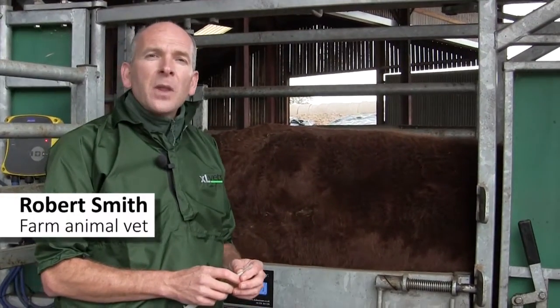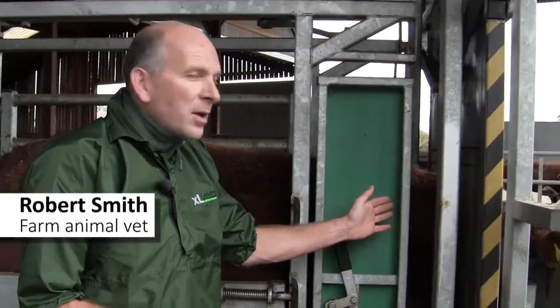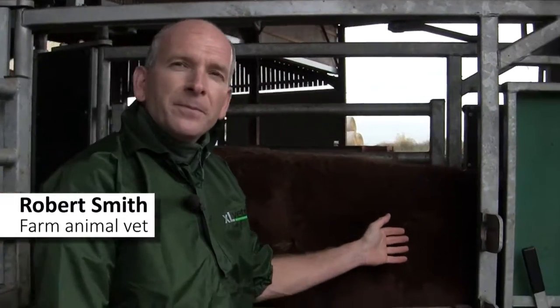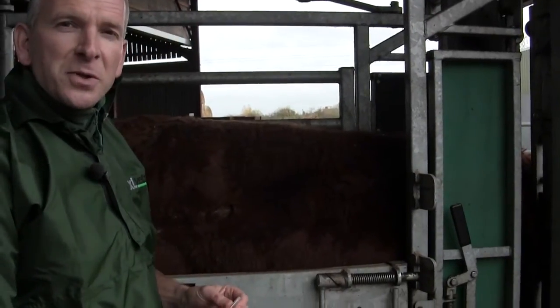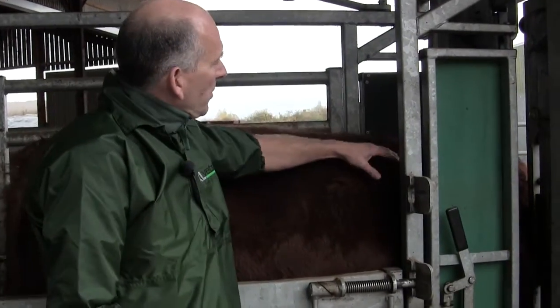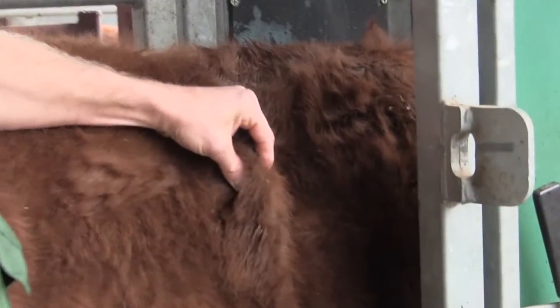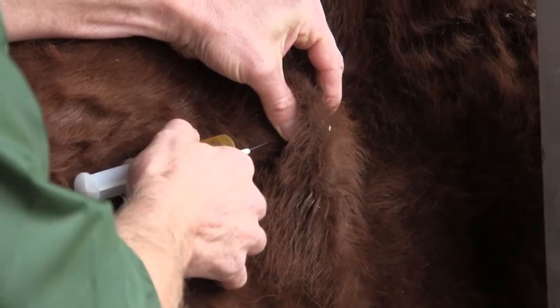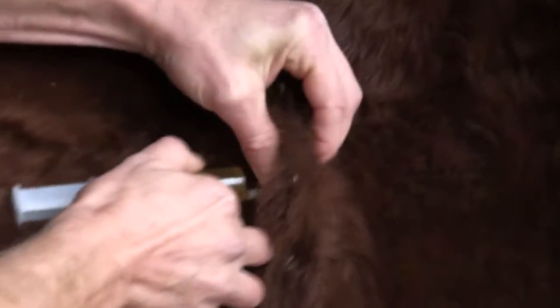Subcutaneous injections in cattle are usually given in the loose folds of skin either in front of the shoulder or behind the shoulder. When giving a subcutaneous injection, what one does is pick up a loose fold of skin at the site, make a tent, and then introduce the needle and syringe through the skin parallel to the body wall.